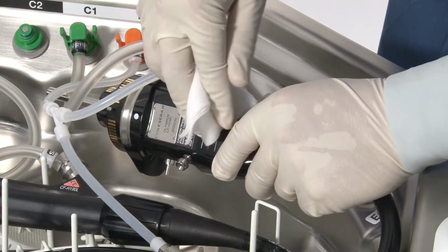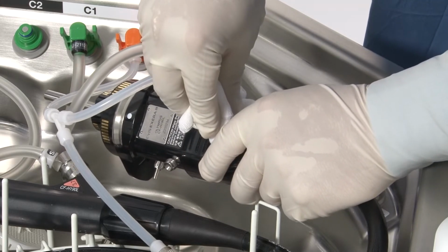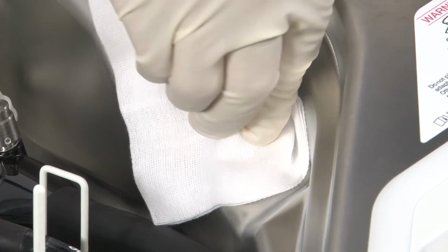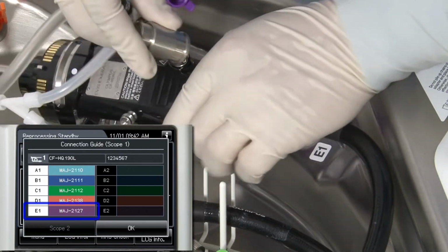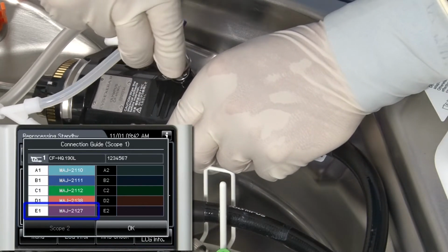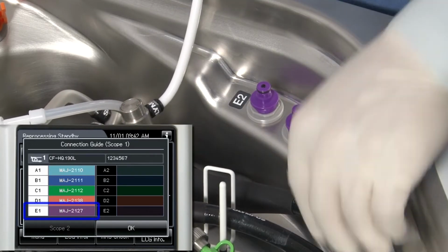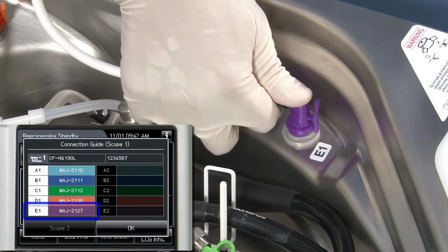If the venting connector of the endoscope or the equipment side leak test connector is wet, wipe it thoroughly with a clean cloth moistened with alcohol. Select the leak test tube that matches the endoscope by referring to the Connection Guide screen. Now connect the leak test tube to the scopes. Be careful not to kink the tube.